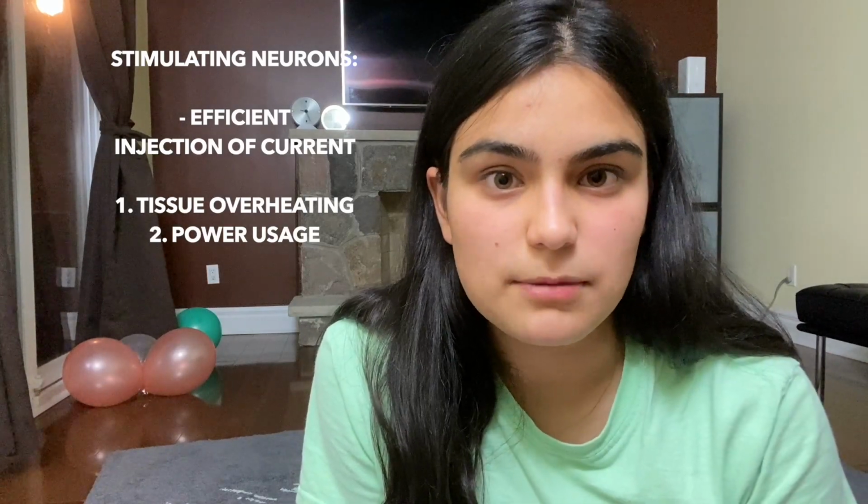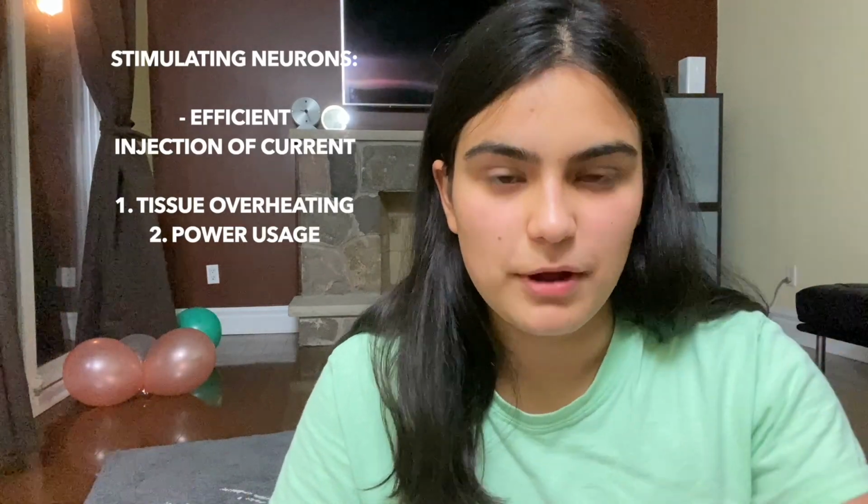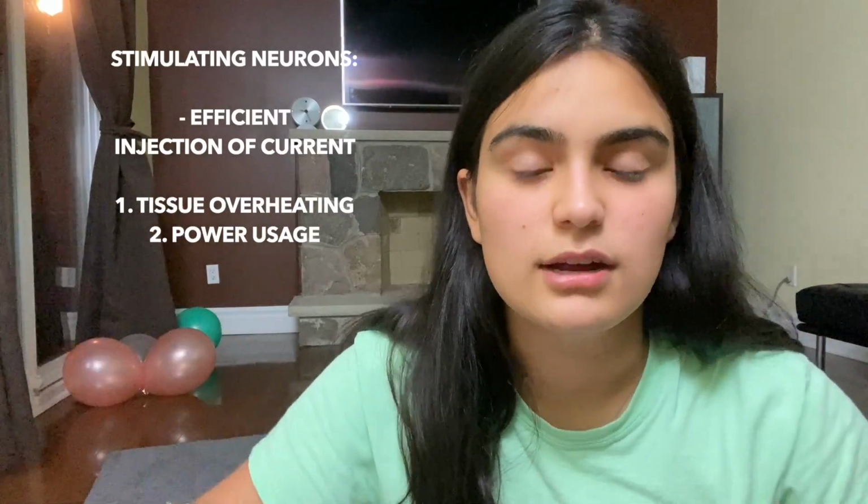And the second thing is power. A lot of these neural interfaces are powered by batteries, and charging them is a whole process in itself. So we want to make sure we can reduce the amount of energy we expend from batteries and not heat up the brain. So in order for both of those two things to happen, we need to reduce the thermal heat that's generated, which means reducing the resistance of the circuit.